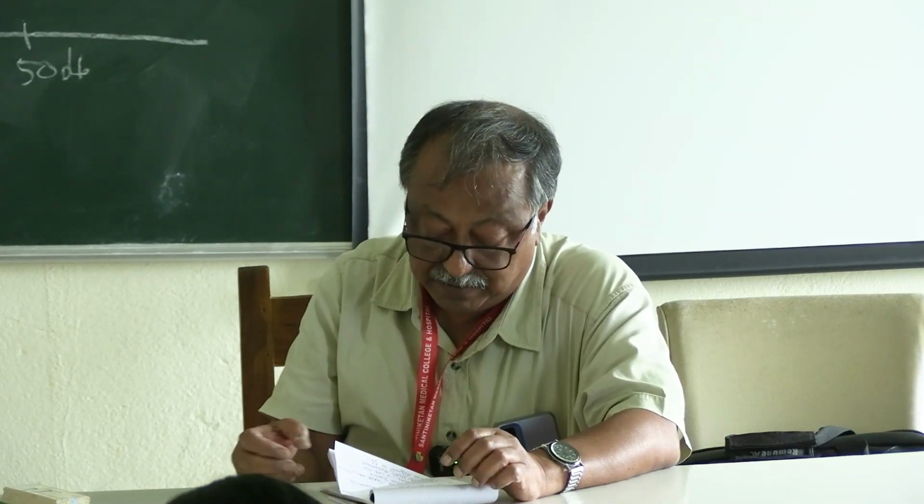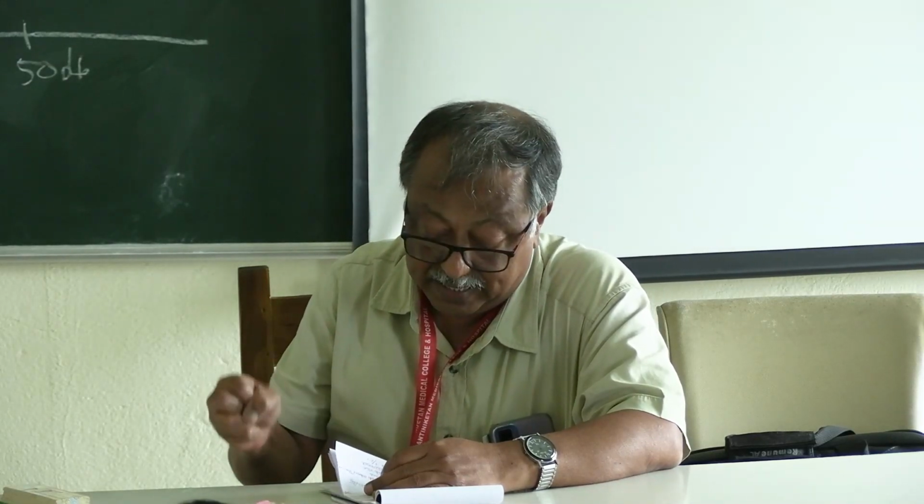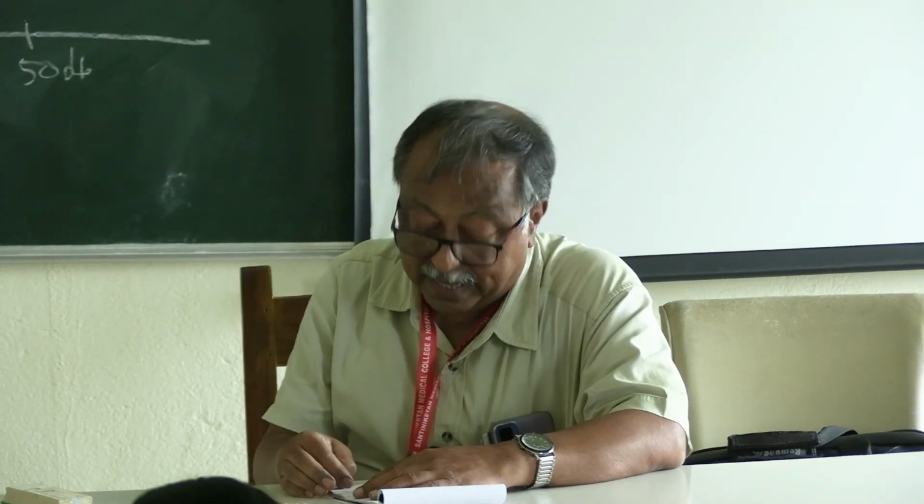Another test is known as the SISI, that is the small increment sensitivity index. SISI, capital SI, that is the small increment sensitivity index. What is done? A continuous tone, 20 decibel above the threshold, sustained for 2 minutes.